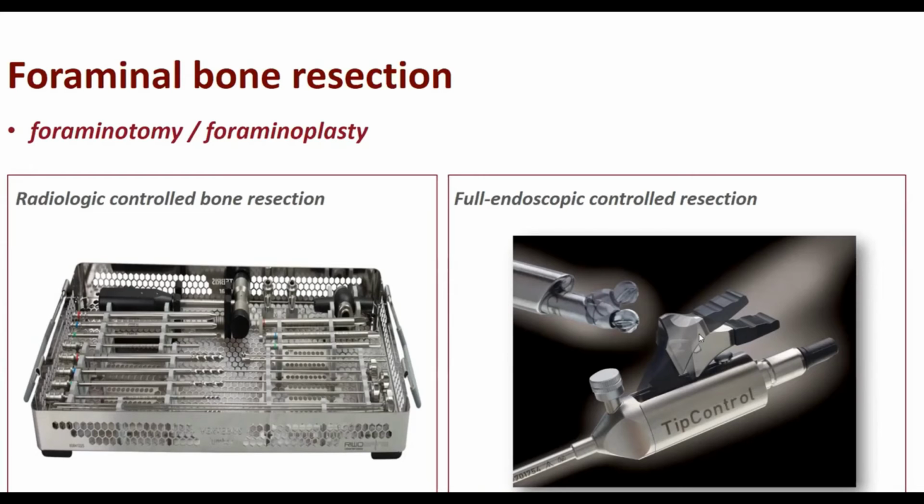The other option for us is to do the extraforaminal approach with the shaver system. Especially we work with the deflectable shavers so that we don't change the direction of the instruments a lot during the operation. As you know, the exiting nerve root and the ganglion can be pinched and squeezed against the pedicle. If you change the direction of the system a lot during the foraminal approach, basically we prefer to do it with the angled instrument.